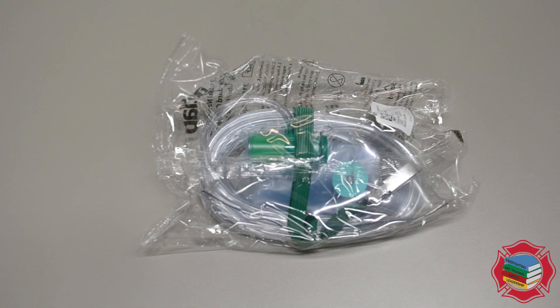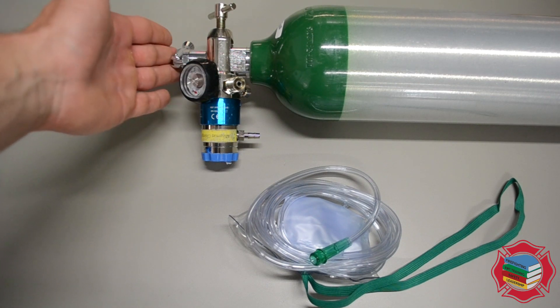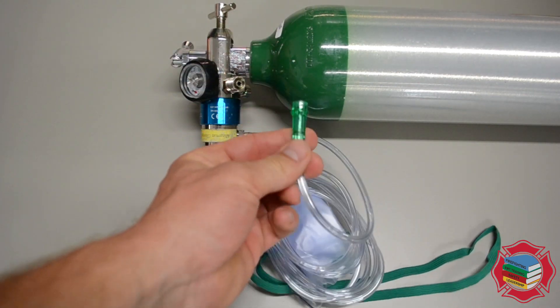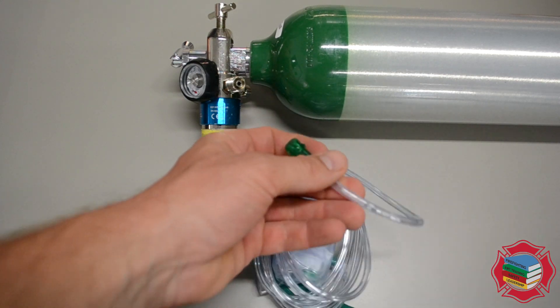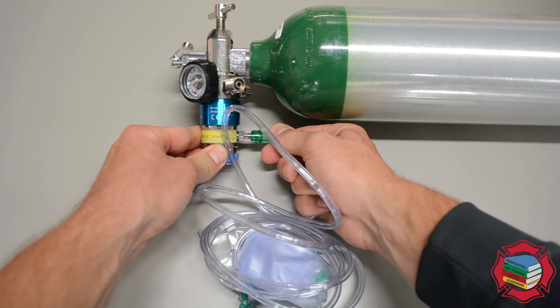These provide up to about 95% O2, though there is some leakage that occurs around the seal of the mask. We'll take this out of the packaging and show you how to use it with an O2 bottle. Here we have our O2 bottle with the regulator assembled and the tank turned on. We'll take this end of the non-rebreather mask — this green side right here — and plug it into the tree. You want it on there firmly but not too tight.